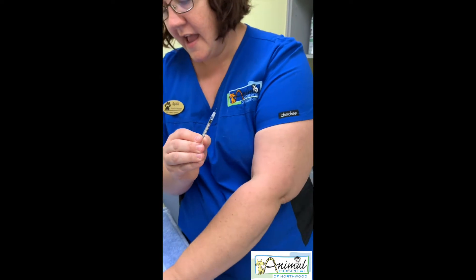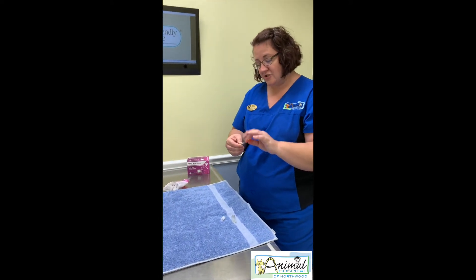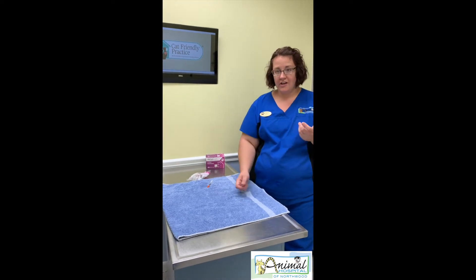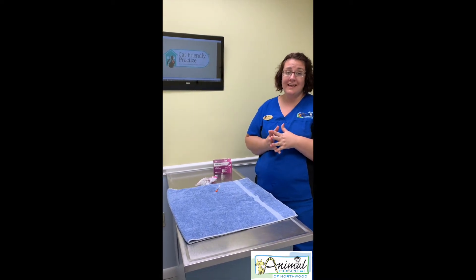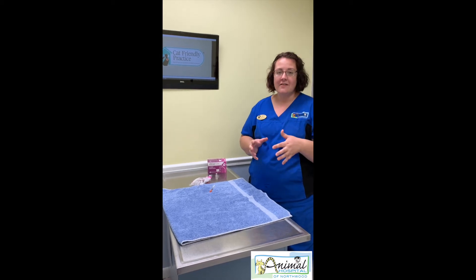Then go ahead and put the cap back on your syringe until you're ready to inject your cat. If you have a helper at home, you could have them assist. Now I want to talk about the location of where to give the insulin injection. For most pets, we're going to give it in an area that has a lot of extra skin.